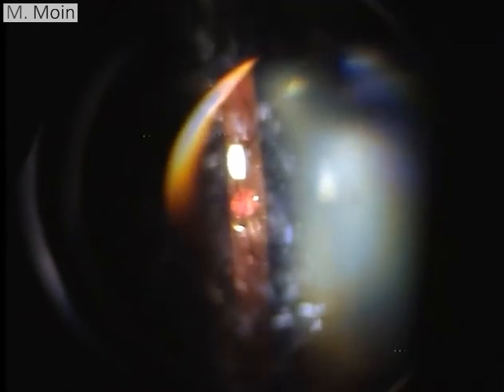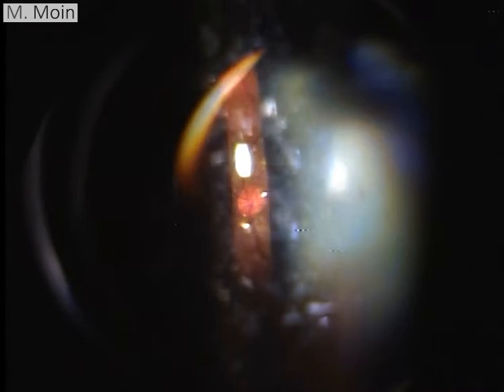In this video we're going to show you a patient with a 90D lens, and here you can see the optic disc, and there's a shine around the disc, and this is signifying silicone oil in this patient. Here you can see the shine of the slit lamp bulb, and I'm going to tilt the lens side to side, and you can see these shining, bright areas where the oil is reflecting.